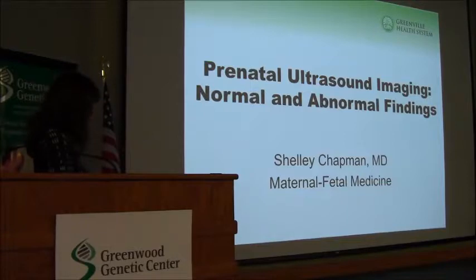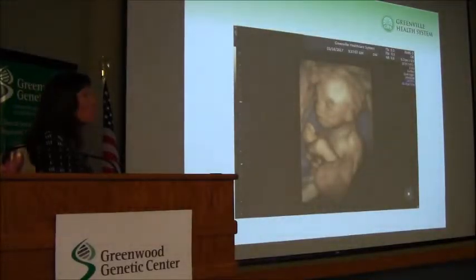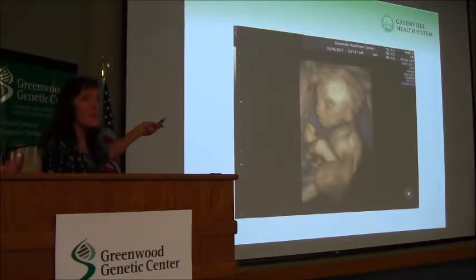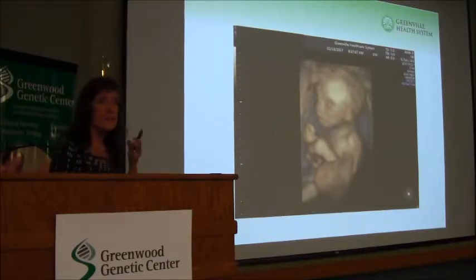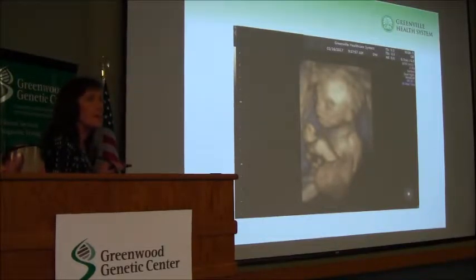So anyway, let me hit all the right buttons. Most of this is going to be 2D imaging. This is a 3D image with our ultrasounds, and rather than highlight the ultrasound techniques, I just want to do what we really do mainly, which is 2D ultrasound. But this is a 3D ultrasound. This is why parents love ultrasound, because they can see, this looks like a baby. Particularly patients that have babies that we're concerned about birth defects, it's great for them to see this type of image where they can see, oh, my baby's not going to look like a monster, because that's what they think when we tell them, oh, there's a heart disease, oh, there's a cleft lip. You guys are astute. We're going to come back to this little child at the end, and I'll let you tell me if you can guess what the diagnosis is on this.